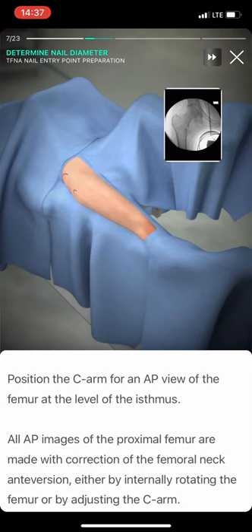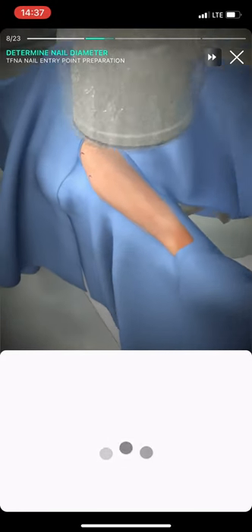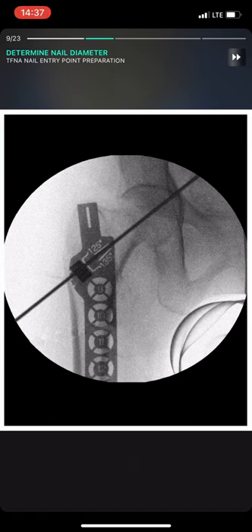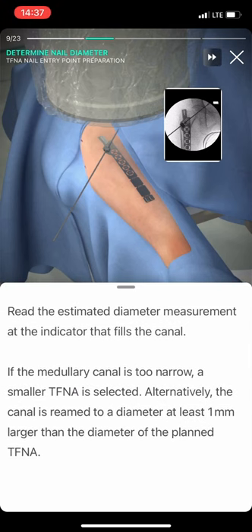Position the C-arm for an AP view of the femur at the level of the isthmus. All AP images of the proximal femur are made with correction of the femoral neck anteversion, either by internally rotating the femur or by adjusting the C-arm. Read the estimated diameter measurement at the indicator that fills the canal.